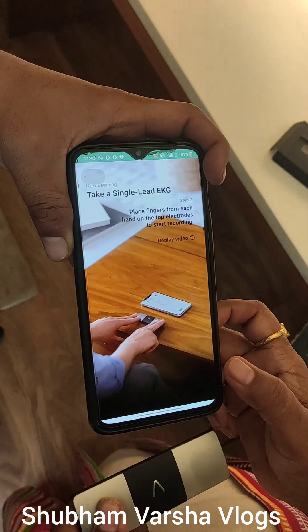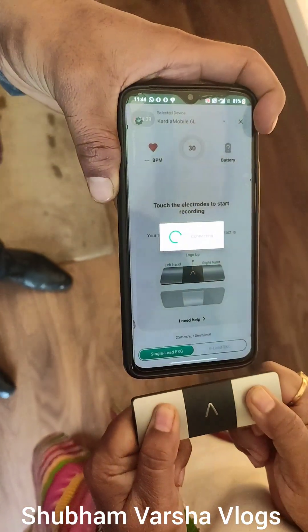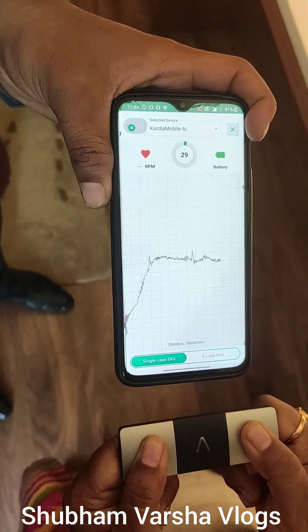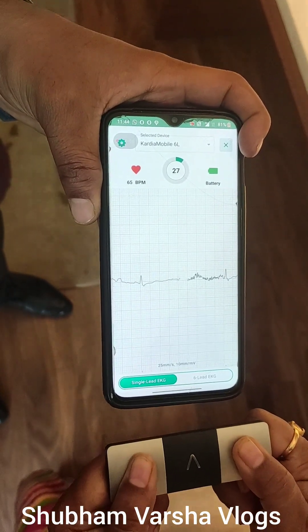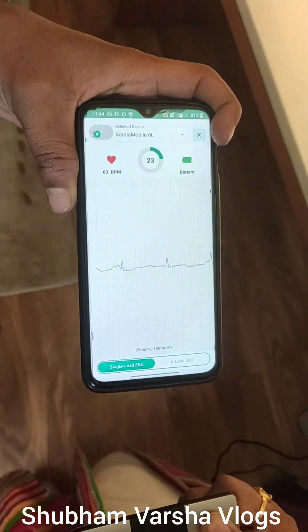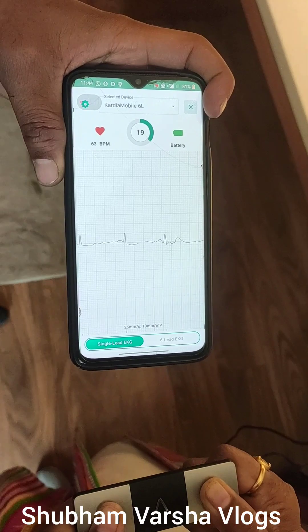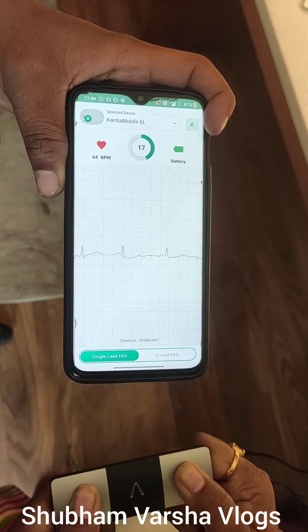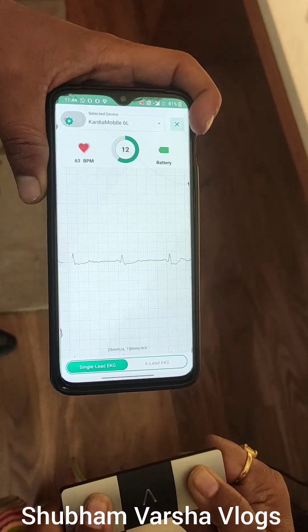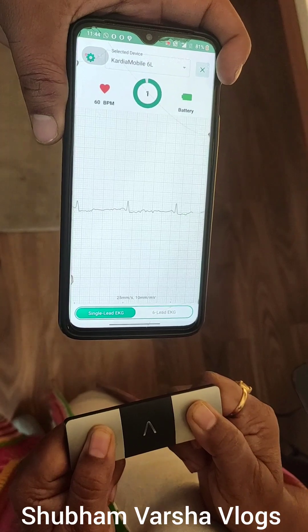You have to put your both thumbs in the proper way and it requires 30 seconds to get your ECG ready. We will wait for 30 seconds. I have also taken feedback from doctors about how this device is beneficial for patients who require day-to-day ECG, and the doctors confirmed that it is beneficial for patients. So, your ECG is ready.